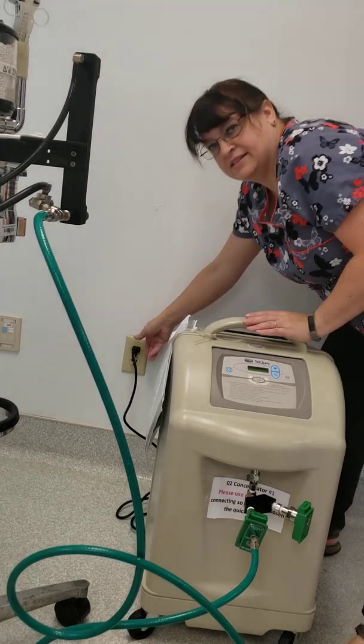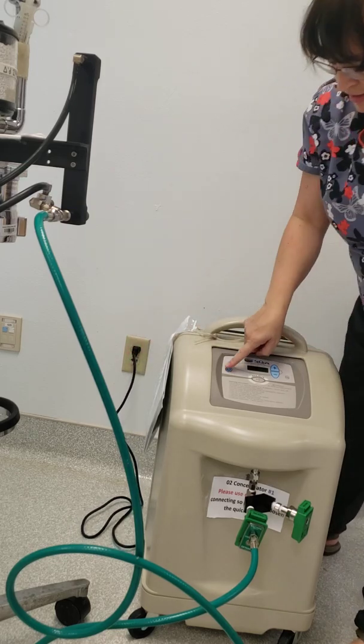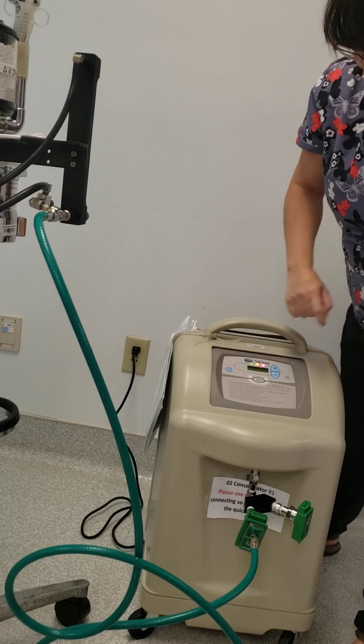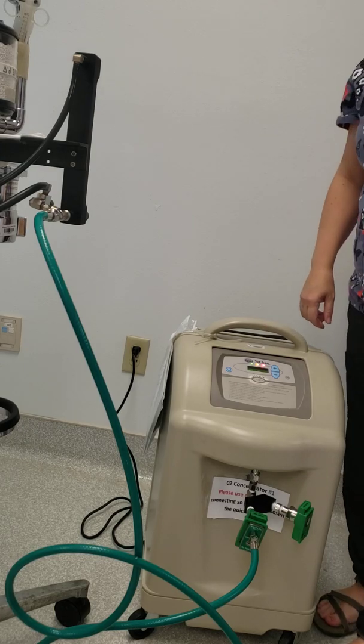There is a plug that you're going to want to make sure you're plugged into the wall. Hit your on button — it's going to need 10 in the window, which is fine for what we need to do with it.